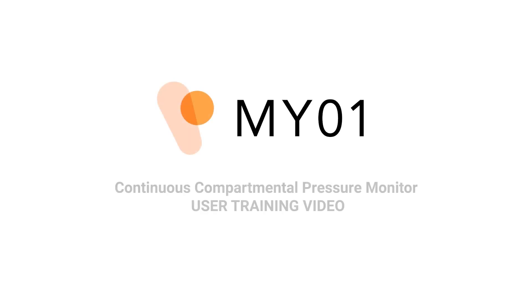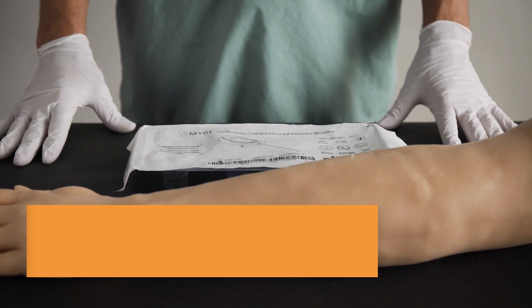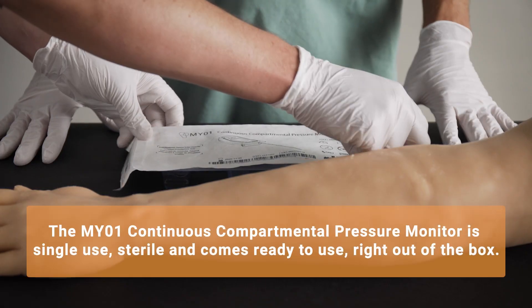The Myo-1 Continuous Compartmental Pressure Monitor is a single-use, class 2 medical device. Each device comes pre-assembled and pre-sterilized in a Tyvek lidded tray.